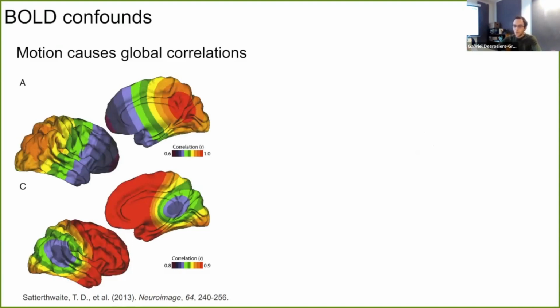So the topic of confound correction can become definitely pretty complex and convoluted. My goal is definitely not to make a literature review on that topic. There's a lot of very good literature on that and very good reviews on what are the different confounds to look at and what are the range of strategies. So what I'm gonna cover here is just the main type of correction steps that you should consider that are available in RABIES and how they are executed within the pipeline.